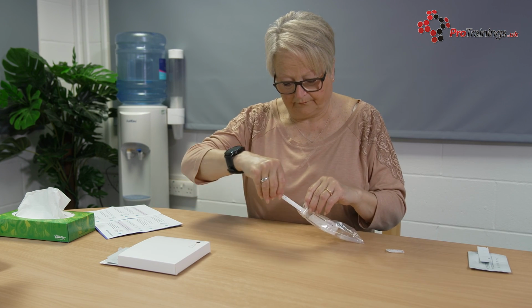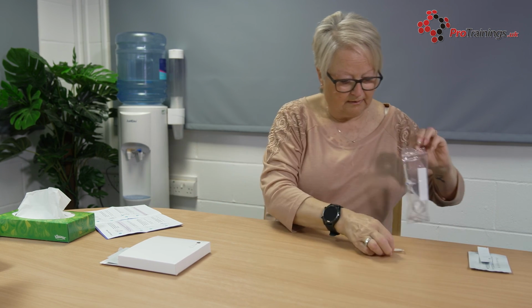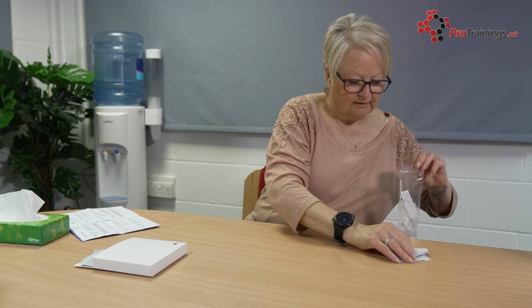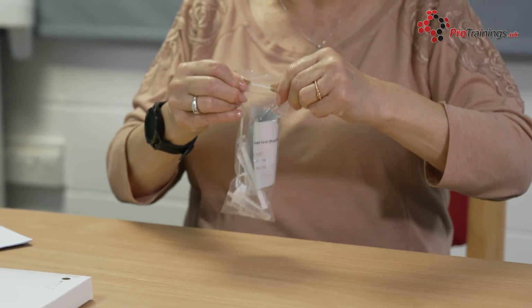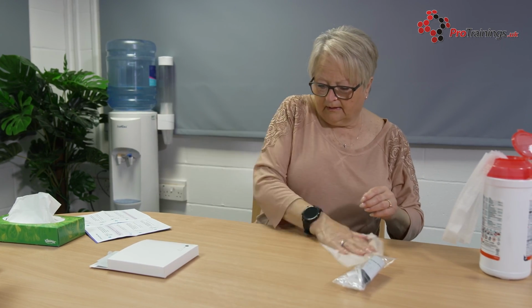Finally, put any used parts of the test into the waste bag, wipe down the surface and wash or sanitize your hands. With this UK test, you will also need to report your results, whether they're positive or negative, and you can do this online or by phone using the QR code or the product ID number printed on your test strip.